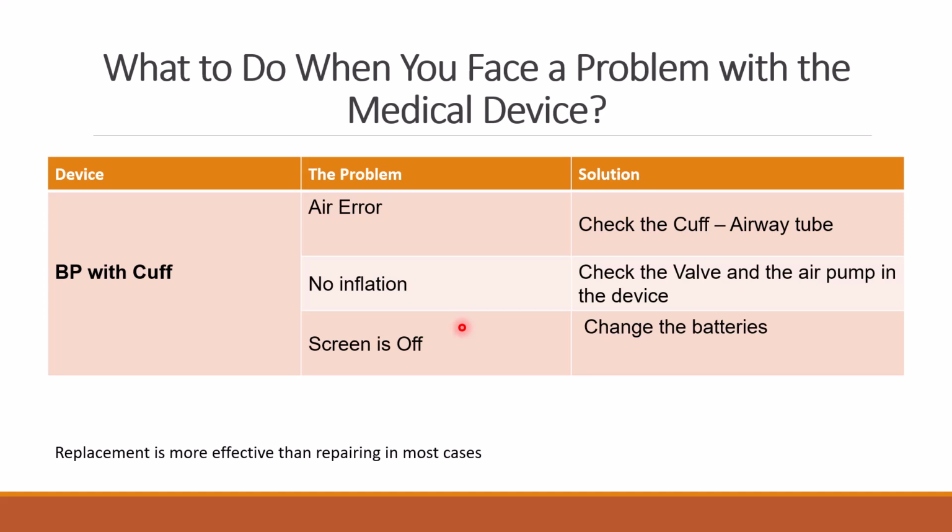Maybe the doctor is going to tell you that the handpiece is not working or there is not enough air. You are going to only release the regulator just to let more airflow come out from the handpiece. So any device working with fluids or air contains compressing devices, transferring tubes, regulators, filters.